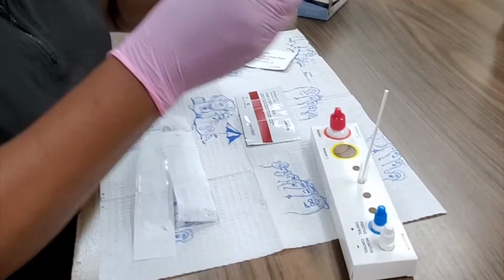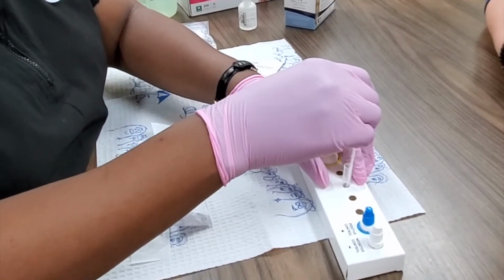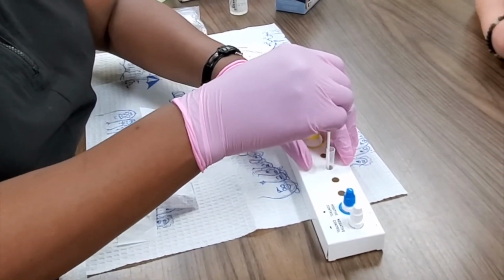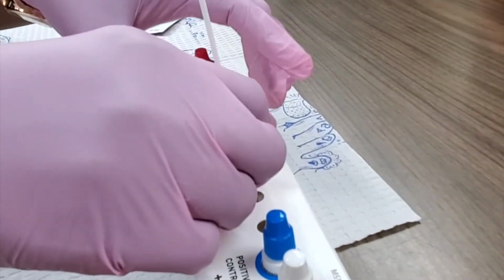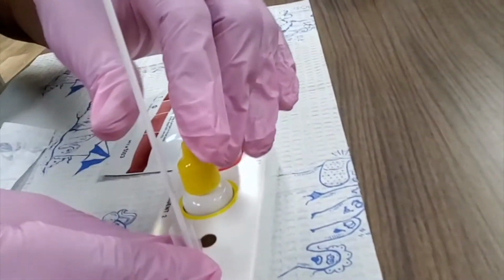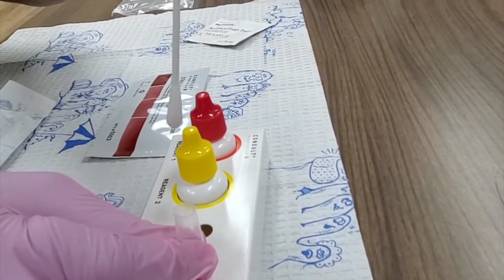Now we're going to take our Q-tip and we're going to mix in the bottom, making circular motions to make sure we've gotten all of the potential bacteria in there. And we're going to take the very flexible plastic container and we're going to squish it as we pull out the Q-tip. That would go into your biohazard container.